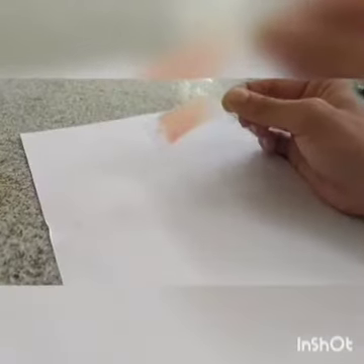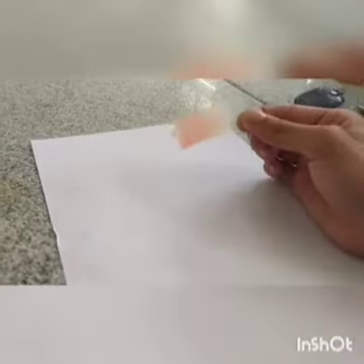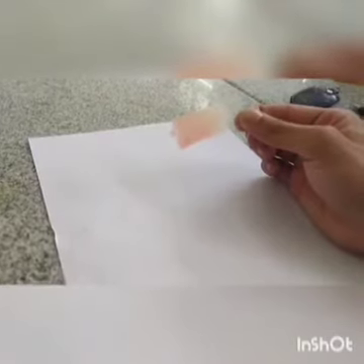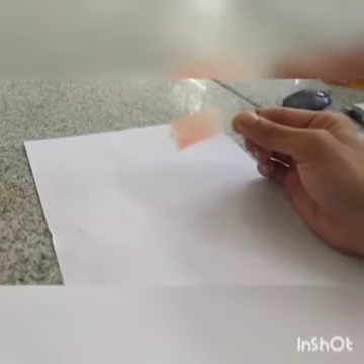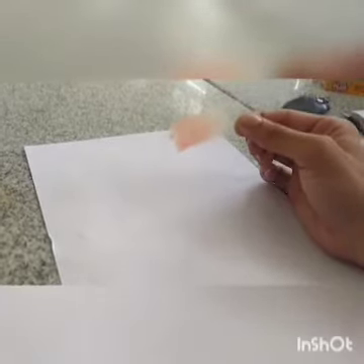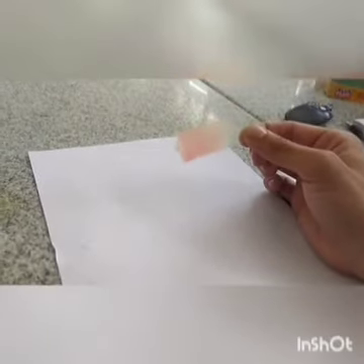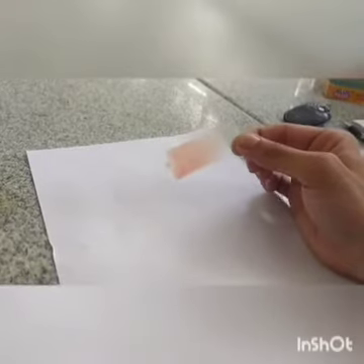Dry the film by waving the slide. The ideal blood smear should occupy the middle two-thirds of the slide. It should be tongue-shaped, no striation, neither very thick nor very thin. It is buff-colored. Under microscope, red cells are separated from each other and there is no rouleaux formation.